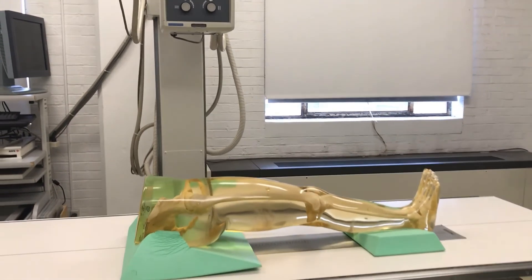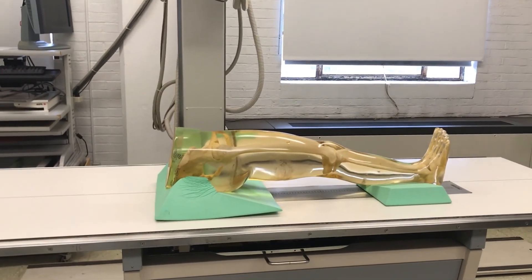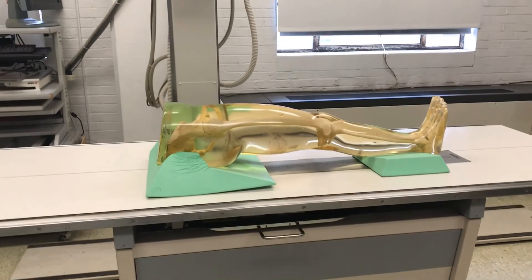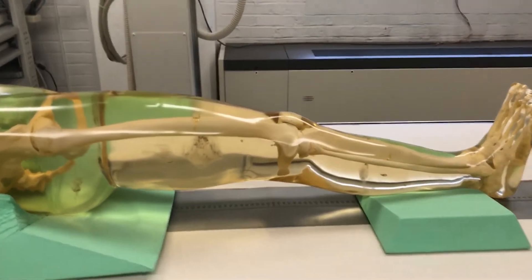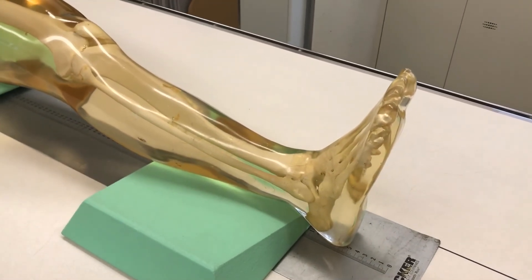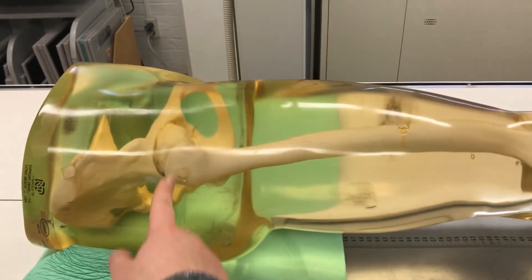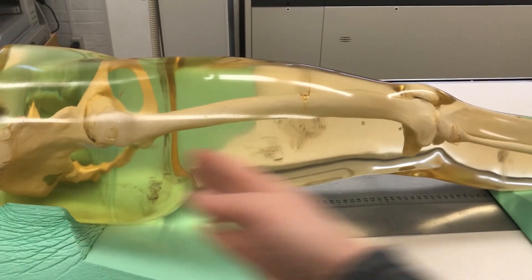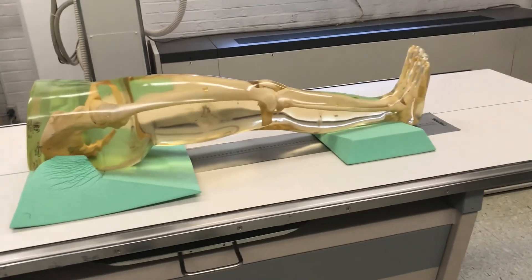What you're gonna need to do first is speak to your patient. Explain to them that it's really important that they stay still and not move around during this study. We mainly do leg length discrepancies — upper extremity is also a possibility. You're gonna have your patient on the table and place the leg length ruler directly underneath their leg on top of the table, making sure there are numbers both at the ankle joint and at the hip joint. It doesn't matter which direction you go, but I like 100 at the top and zero at the bottom. You may need to use some sandbags at their ankles so they don't move.